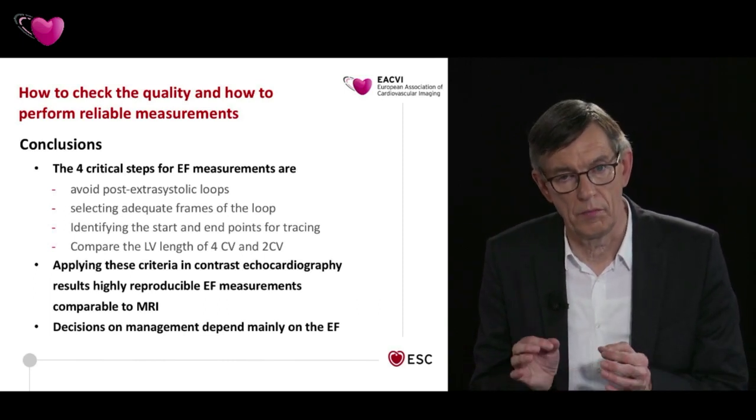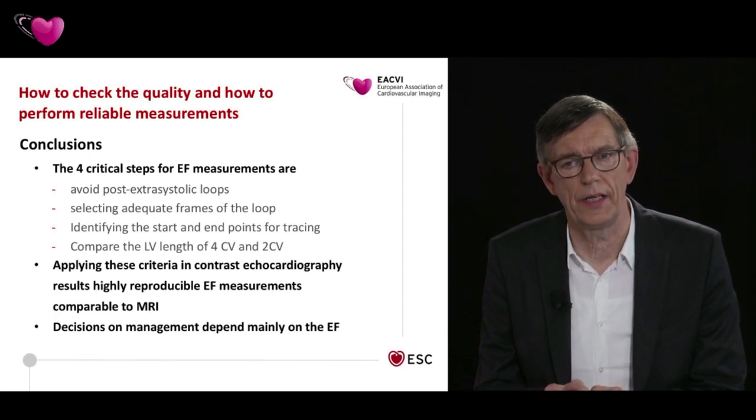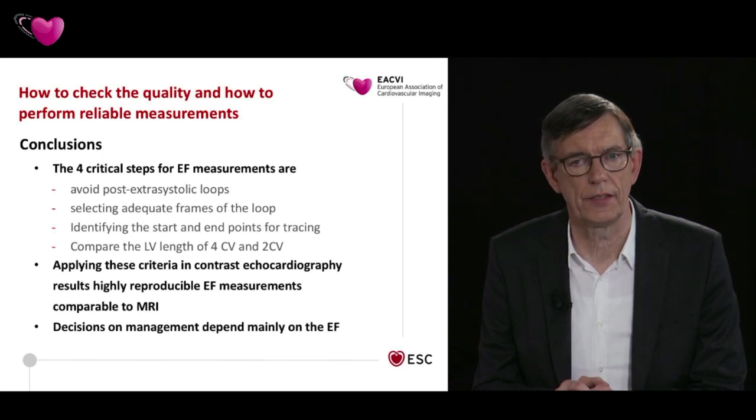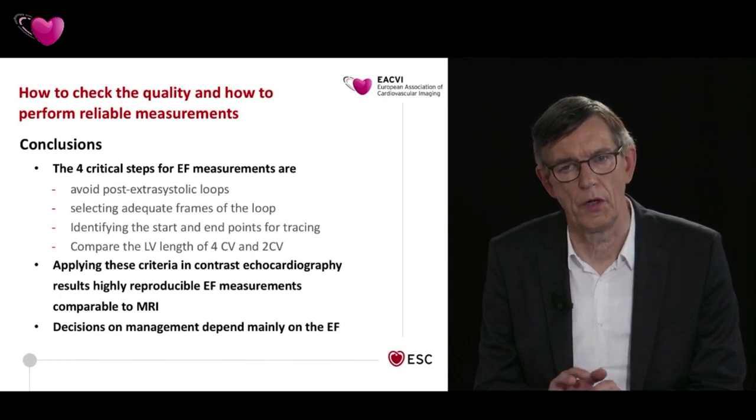We have to be very cautious in identifying the start and end point for the tracing, and we also should always compare the LV lengths in the 4 and the 2-chamber view. Applying these criteria in contrast echocardiography results in highly reproducible EF measurements comparable to MRI, as we showed earlier. Decisions on management depend mainly on the ejection fraction.